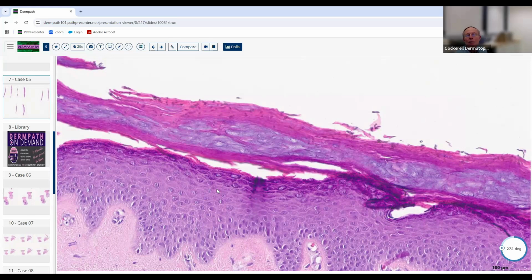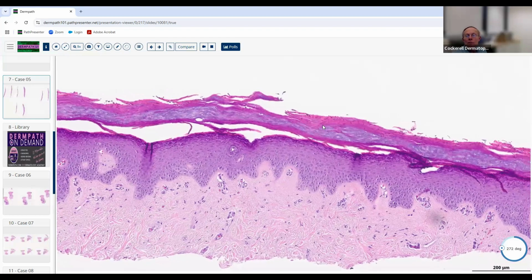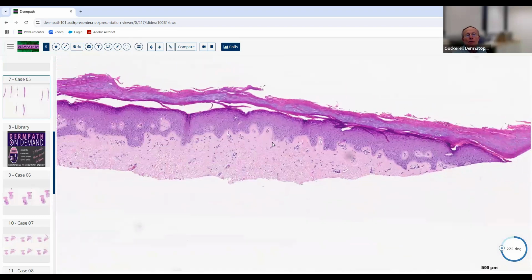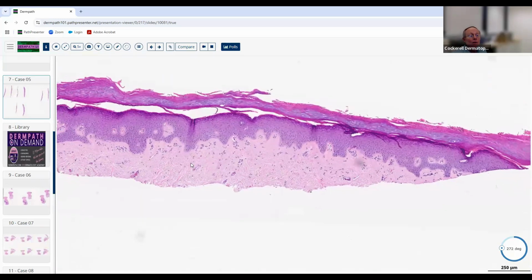Dr. Ackerman actually wrote a text on that years ago, about what clinicians can think of, so you can say, now I know why they thought that, because it can look like this. You have to know clinical dermatology to know what those clinical miscues are. So it's important to know where you're going to make a mistake. This is a classic one where the clinicians think it's a melanoma, and it turns out to be this. Hemorrhage in the cornified layer is another classic example where it's thought to be melanoma and it's not. When you're dealing with nail unit pigmented lesions, that is often just secondary to trauma. It's not really a pigmented lesion at all.